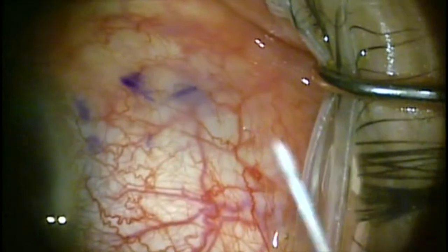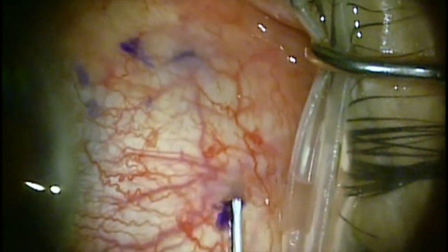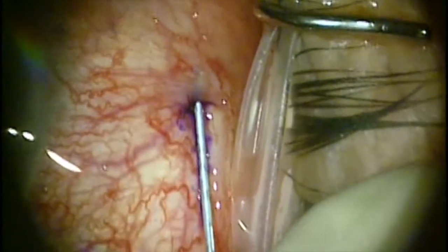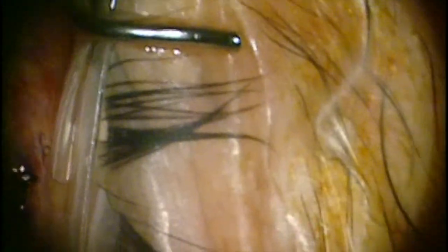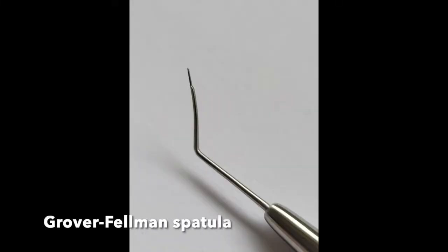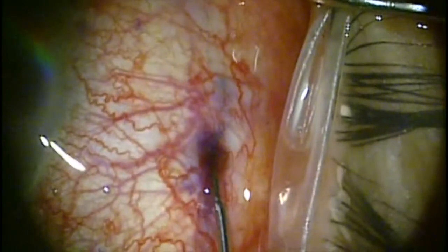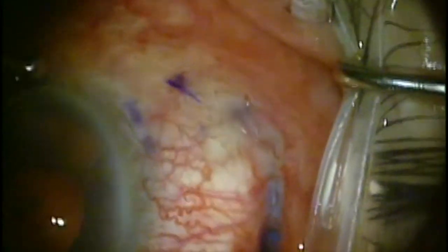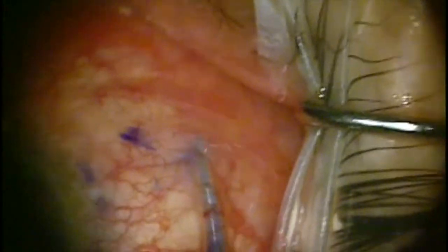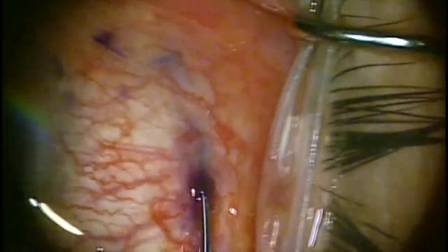You can confirm the position of the Zen Gel stent with gonioscopy. It's very common now to do a primary needling at the time of surgery. This is done by inserting a 27-gauge needle about 8 millimeters temporal to the Zen Gel stent placement, and it's good to mark it with a marking pen so that you can see exactly where you inserted into the conjunctiva. Then you can use a Grover Feldman spatula to be inserted along that same track and then dissect both anterior and posteriorly to the Zen Gel stent, making sure that everything is freed up in the subconjunctival and subtenon space so that there is a nice pocket for the aqueous to flow into.